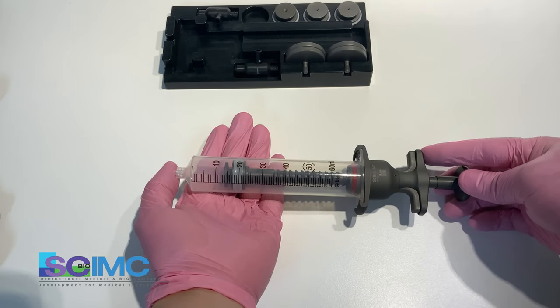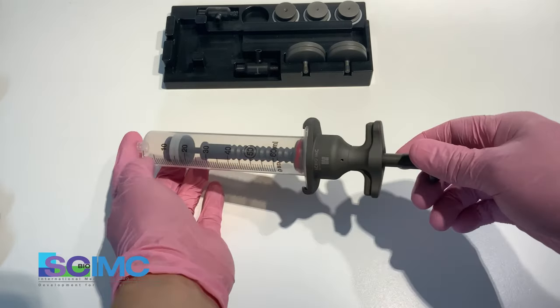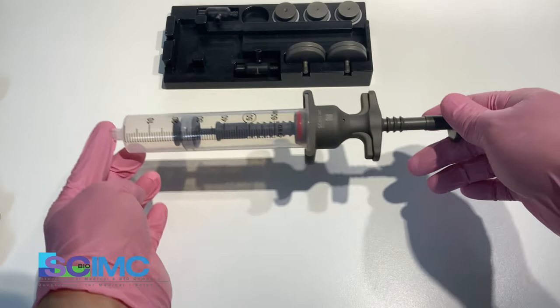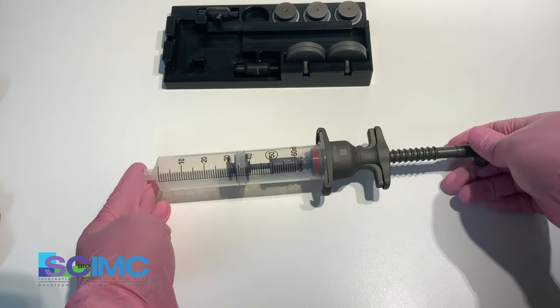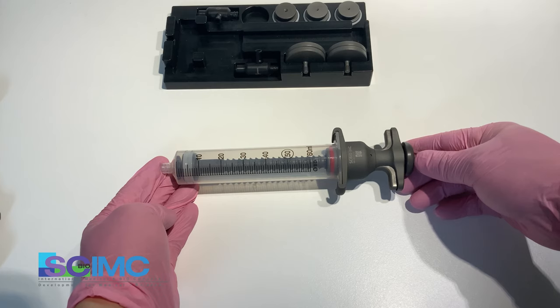The negative pressure is 500 mmHg. Or, if you want to make more negative pressure, pull back the plunger further — pull the plunger over 30 cc. This device is able to adjust the negative pressure.